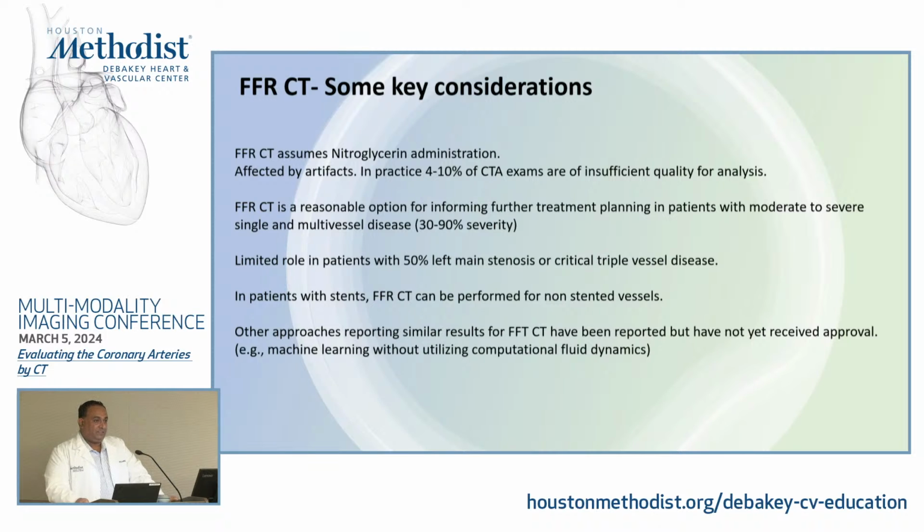We just talked about 3-vessel disease, but if I'm talking here critical triple vessel disease, there's no reason to go around doing FFR. That needs revascularization. Remember, in patients with stents, FFRct for the most part can still be performed for non-stented vessels. And then finally, there are other companies that are developing other approaches for calculation of CT-FFR, other than HeartFlow, that may not involve the copyrighted computational fluid dynamic algorithms from HeartFlow. For example, one of them is based on an algorithm using machine learning, but they are not FDA approved at this point.